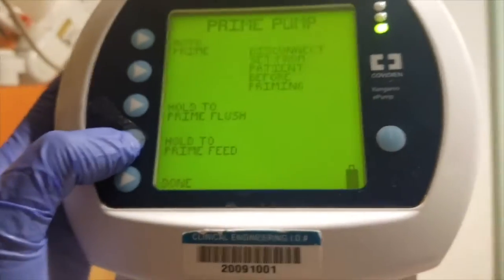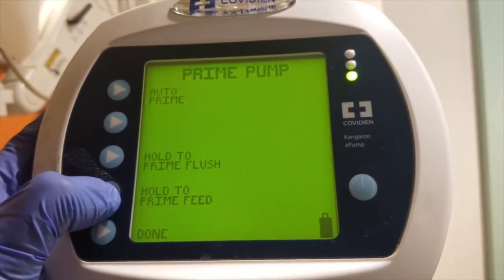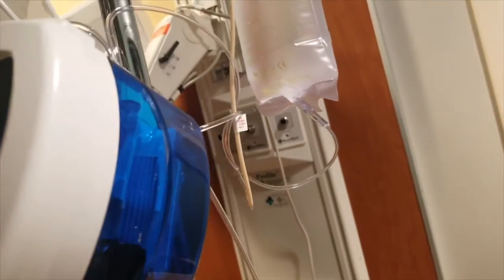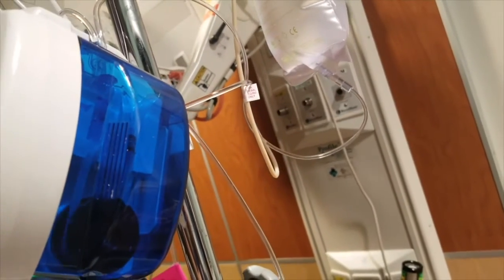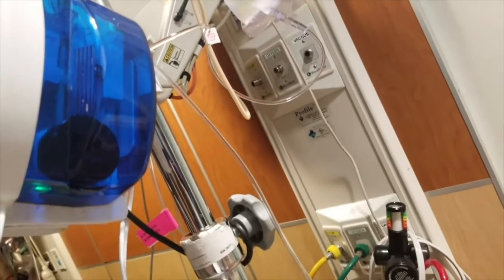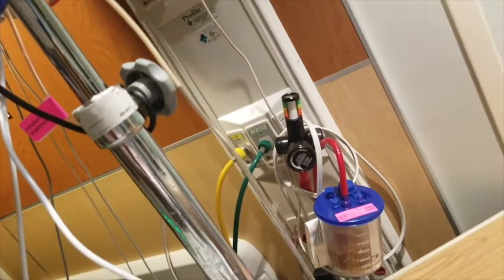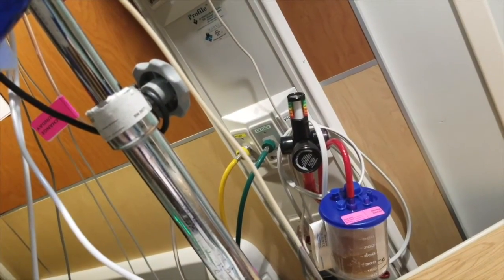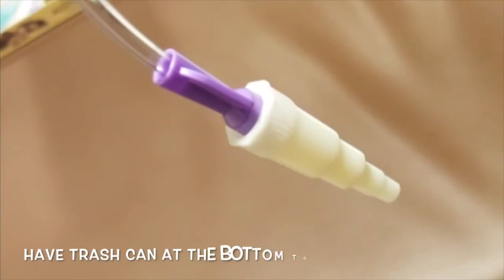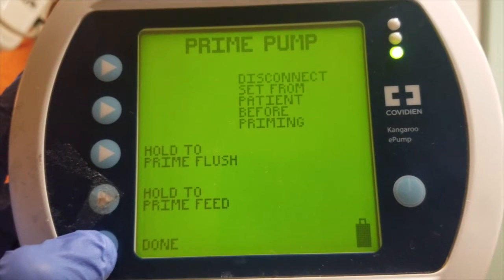Now press and hold the button that says hold to prime feed. Keep holding it until the formula reaches all the way to the end of the tubing. You are now finished priming the tubing. Press done to return to the main menu.